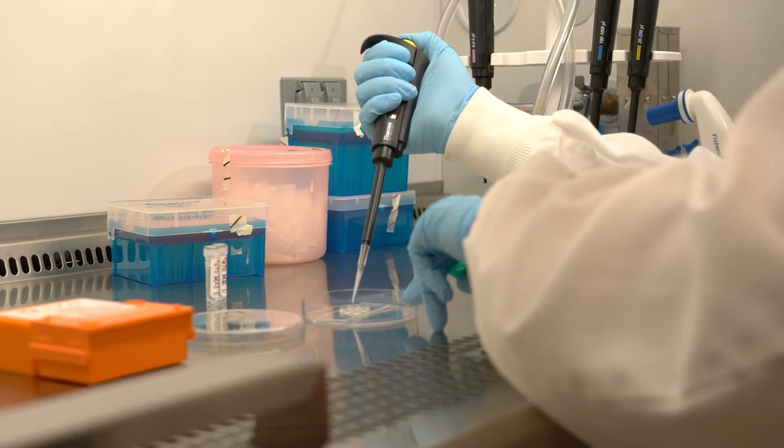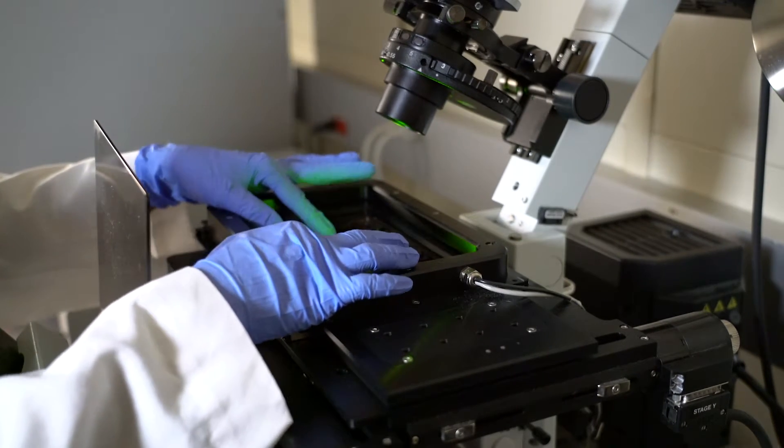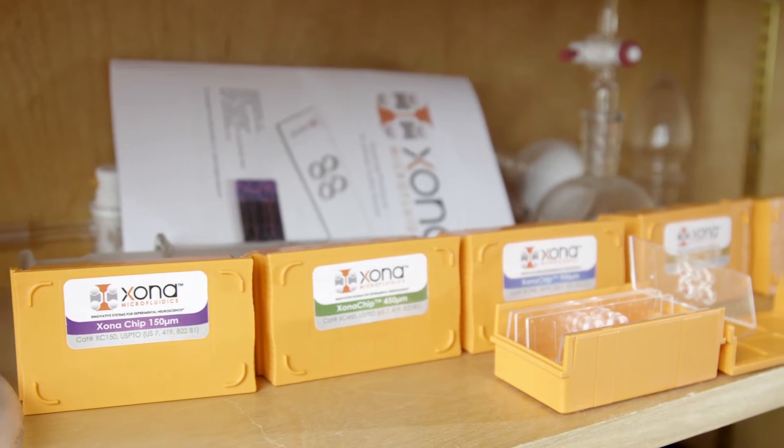Zona chips are really compatible with high-resolution live and fluorescent imaging. The Zona chip is really clear, and you can place the Zona chip as it is on the microscope, since it's a standard size as well.